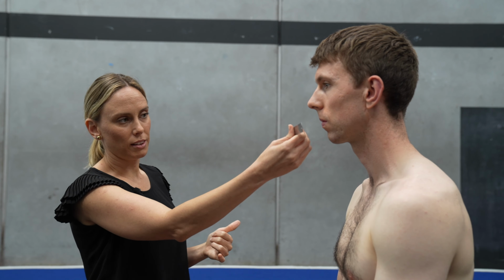If we're wanting to compare to normative, or if we're doing anything like, let's say he's got a problem with the protrusion movement, I might want to be recording that. So for example, if he's moved forward 5 millimeters, but he's starting back 2, so he's got an overbite of 2 millimeters, he's actually got a protrusion range of 7 millimeters. So it's 2, which is bringing us to 0, and then it's 5, which is what I'm measuring with the ruler.